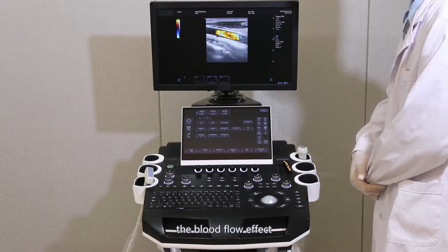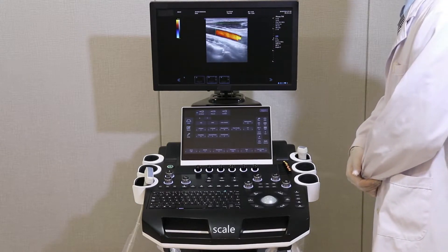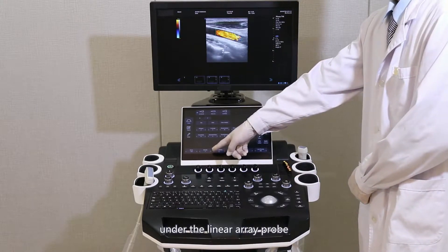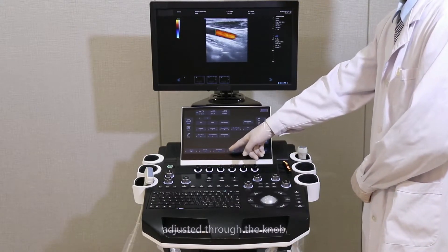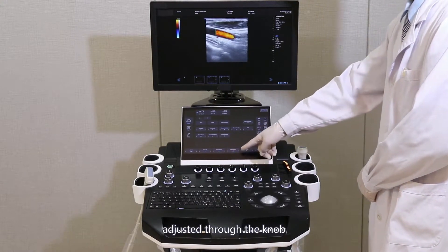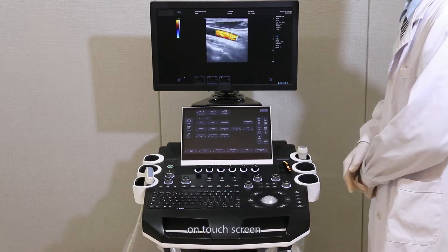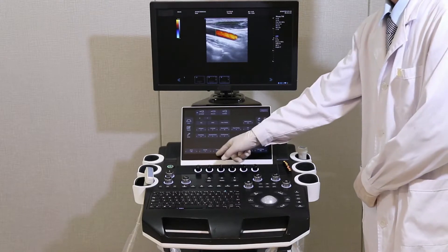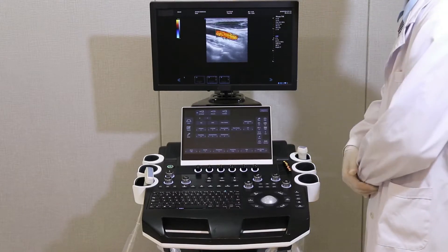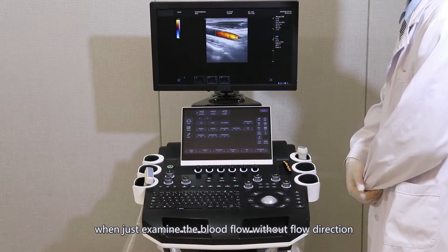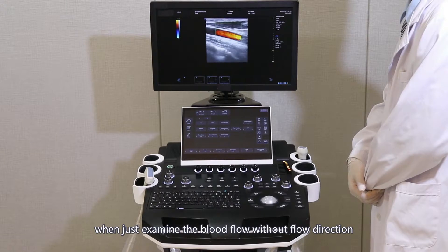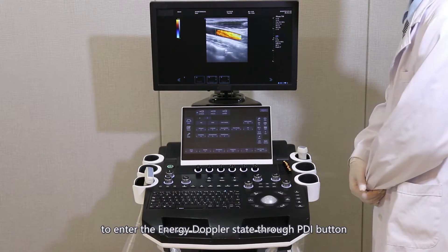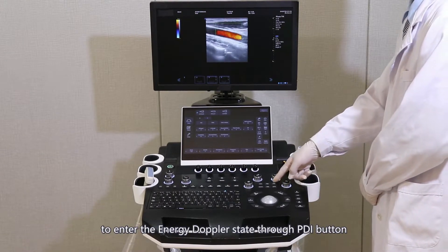The blood flow effect, scale, and deflection angle under the linear array prop can be adjusted through the knob on the touch screen. When examining blood flow without flow direction, enter the Energy Doppler state through the PDI button.